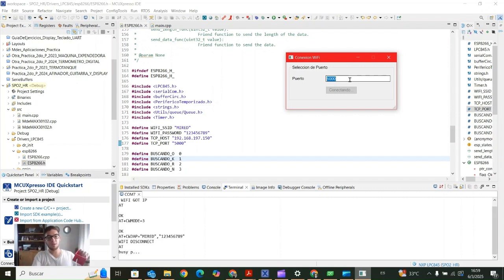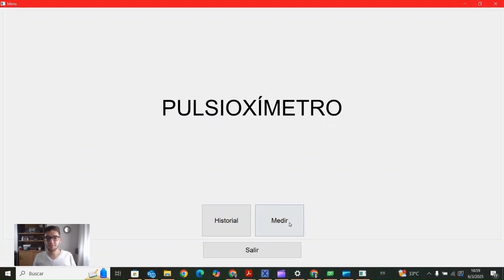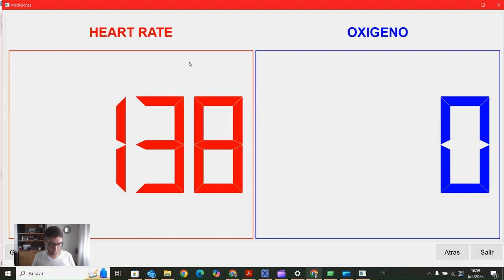Okay, now we have this. First of all, it appears in TCP mode. Some messages are being sent to the ESP, and the ESP responds. Now, the user interface has been opened, and the red light of the sensor is also turned on. Okay, that means that we have established the connection properly, and now we are going to try some measures. We are going to click the button medir, measure. We see two sections, heart rate and oxygen. I'm going to try with my index finger.